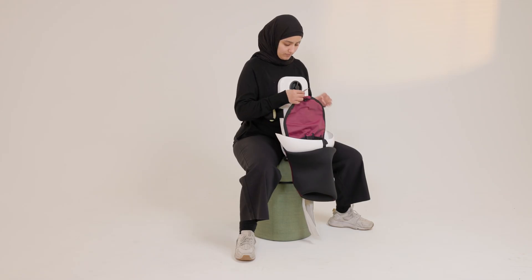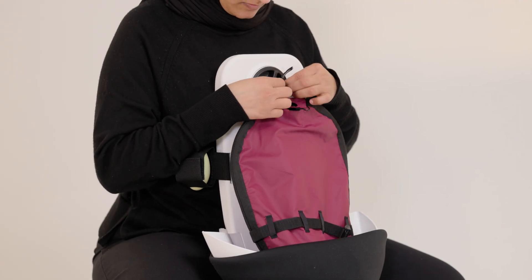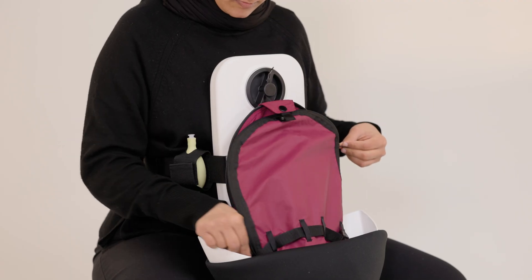Fold the stomach down and hang the uterus over the hook. This will keep the uterus in place when delivering Neonataly and the placenta. Open the uterus.